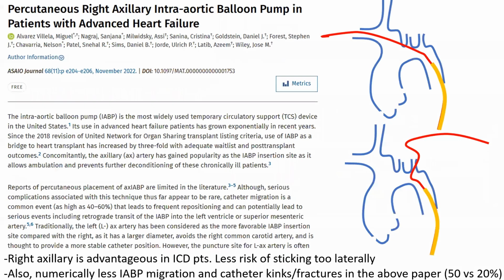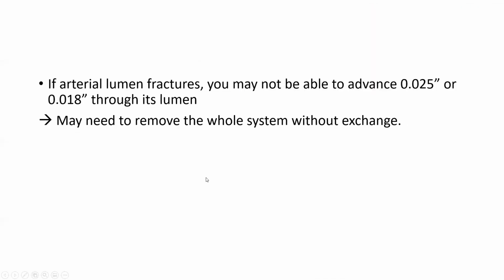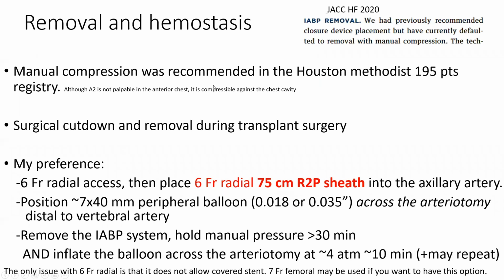So we really need to know very much the steps of how to exchange that malfunctioning axillary balloon pump, because it will happen in close to 30% of patients. Another technical idea here is how to remove that axillary balloon pump and achieve hemostasis.